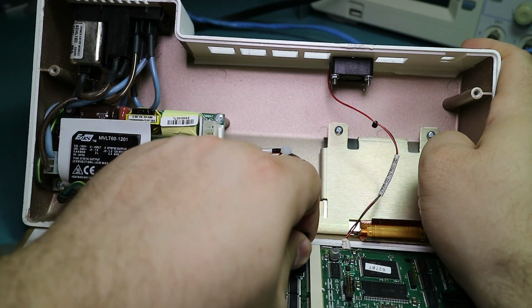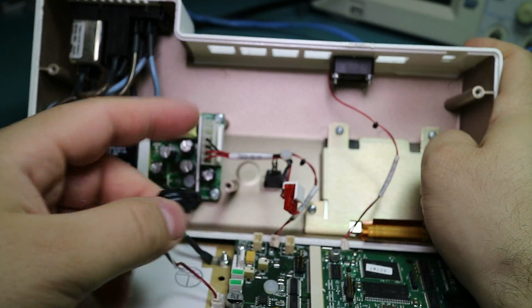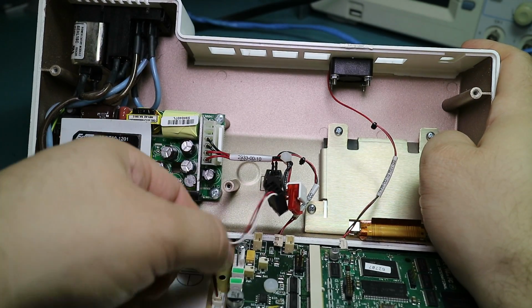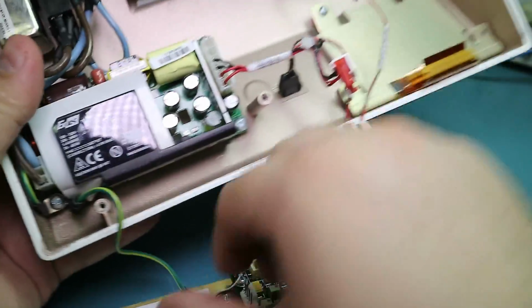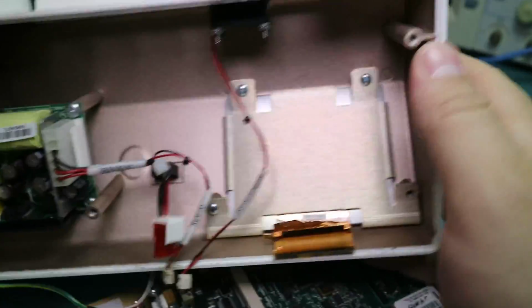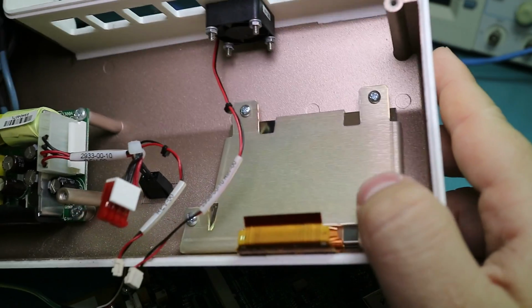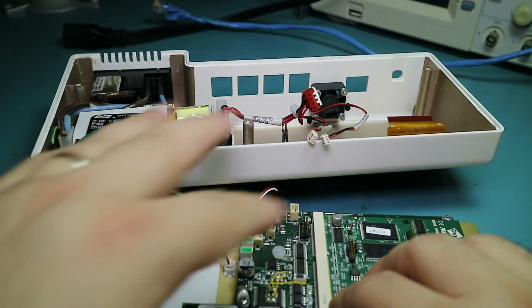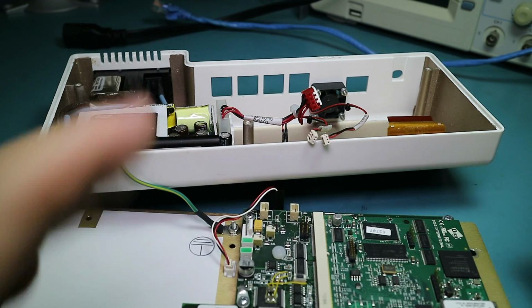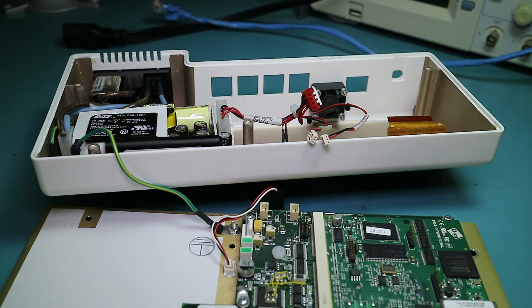And then there's also this small header connector which runs down to that mystery connector at the bottom. And on the top, oh yeah, and there's also the ground strap. On the top you can see there's just the LCD and the fan, which is made by someone. I don't know. We'll get into that in a bit. But I'm just going to go ahead and disconnect all this stuff and get the board out so we can take a closer look at the board, because that's really the only thing in here.